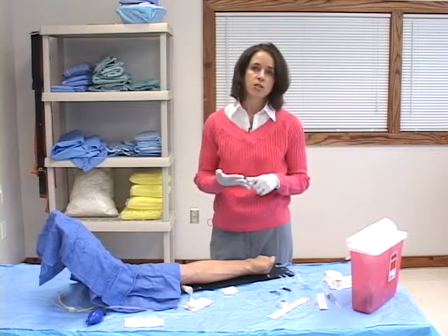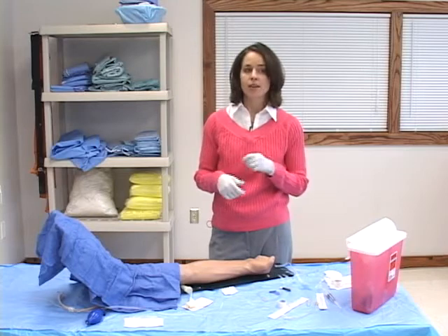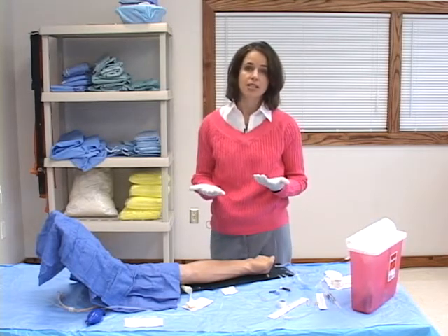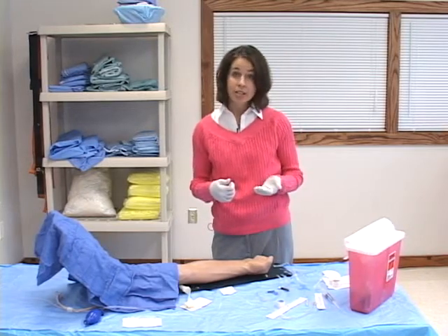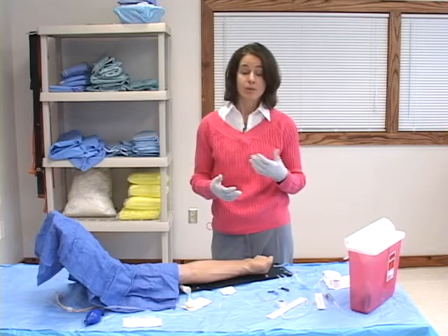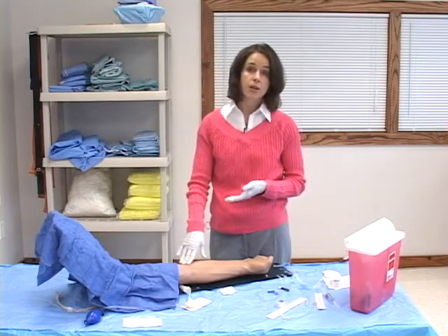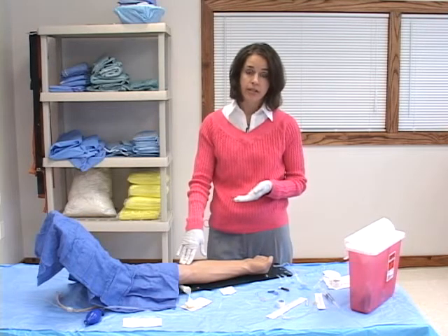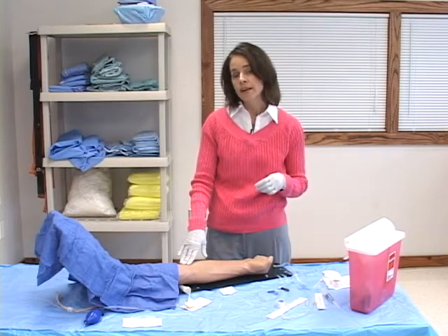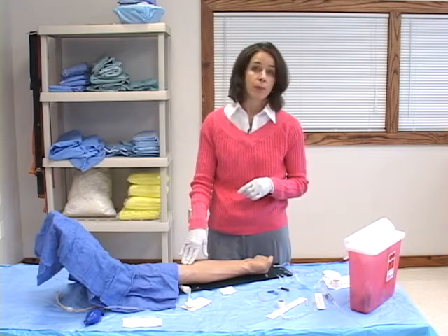And then you also have your traditional places that you would look, such as the dorsum of the hand, veins on the radial aspect of the hand. And something to keep in mind for a pediatric patient is that they may be a thumb sucker or a finger sucker, and you want to make sure that you're not starting an IV in the hand for which they would suck a thumb or a finger. The antecubital fossa is also another good place to start an IV, but you need to keep in mind if this patient is going to need long-term IV antibiotics or prolonged IV access, the antecubital fossa is where a PICC line would be placed.